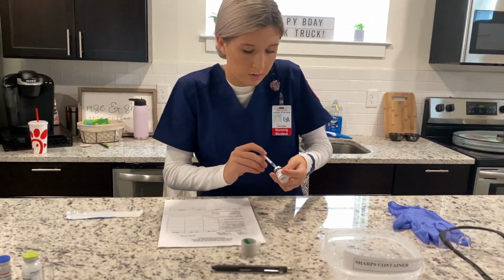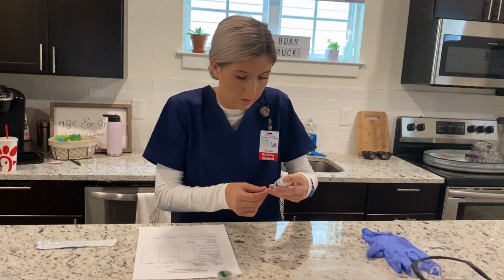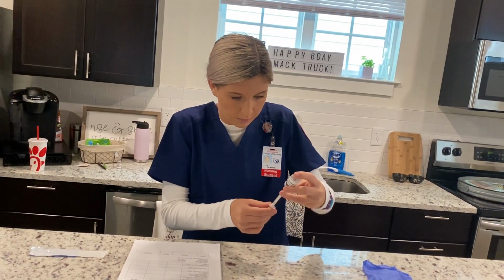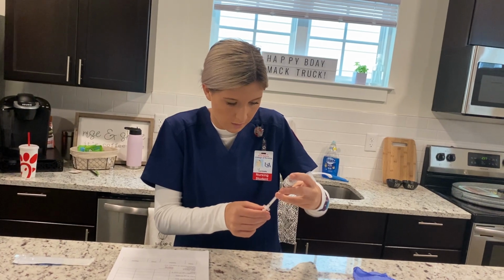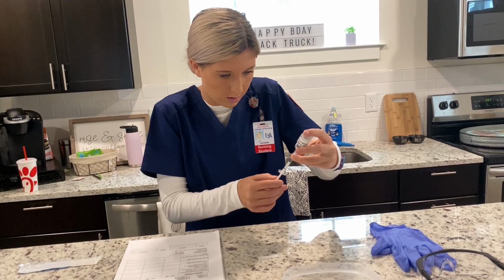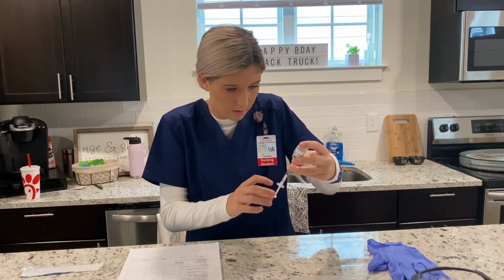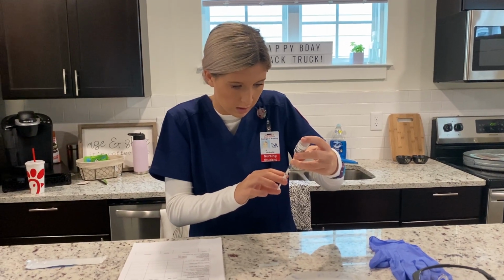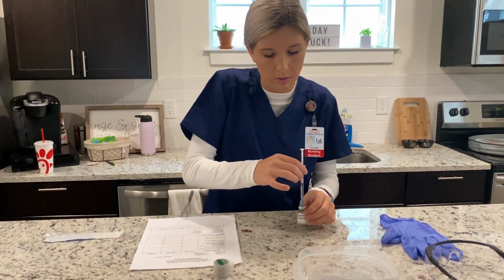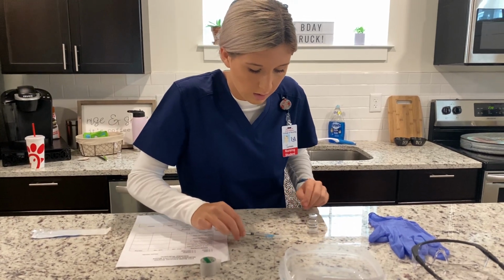And then I'm going to turn this upside down, and I'm going to take up 0.5 milliliters, or a little bit more than that, of the heparin. And then I'm going to flick out the bubbles and release any excess to make sure that it's exactly 0.5 milliliters. And then I'm going to recap using the scoop method.